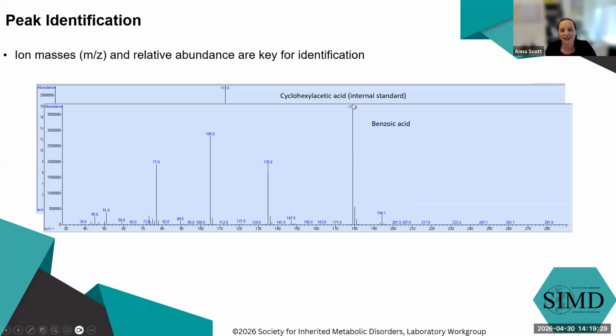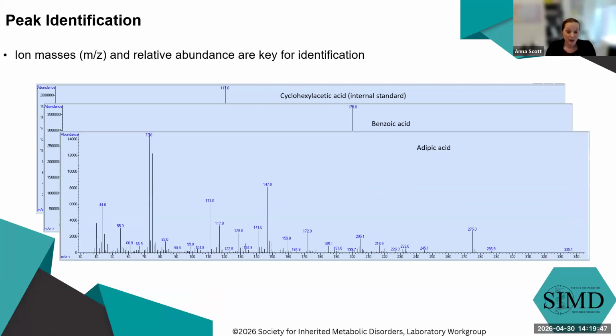I kind of think of this as almost like a little kid's slide with a hump in the middle. So there are these visual characteristics of some compounds that make them very easy to spot. And again, we're also looking at the particular retention time on our instrument to help with that identification. But these fragmentation patterns can be highly variable. So here's adipic acid, another common friend in urine. Primary signal is this guy right here. I don't know how to describe that, but it's a characteristic little loop-de-loop of mass fragments. And those masses are conserved. And again, the relative ratio of these guys should be very steady.